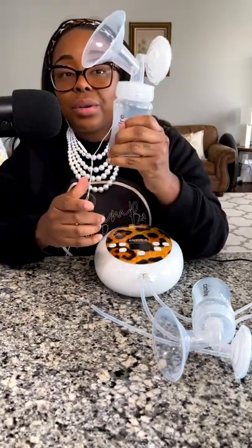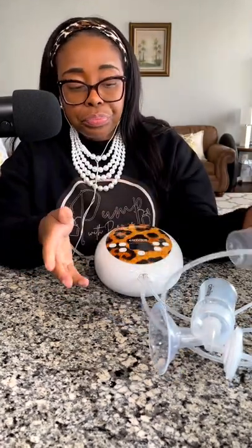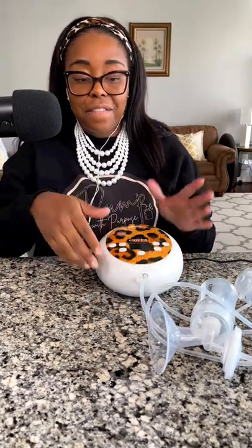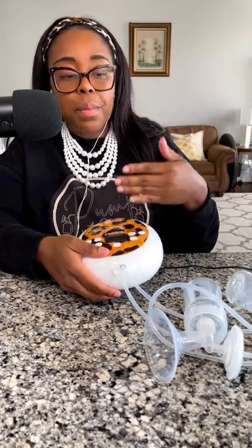The bottle assembles on top and the tubing connects here. If you want a single pump, you can always take one side out and close it up. So now let's get into the operation of the pump as well as my initial thoughts.